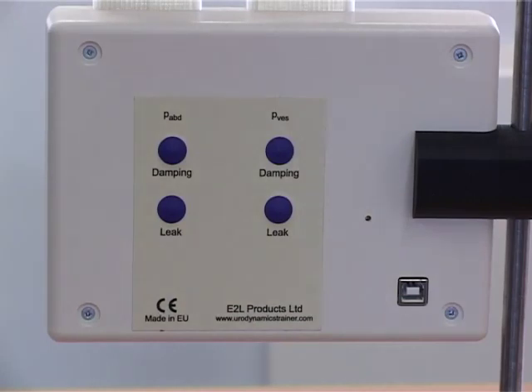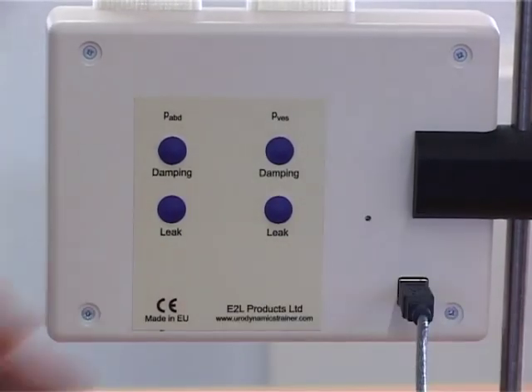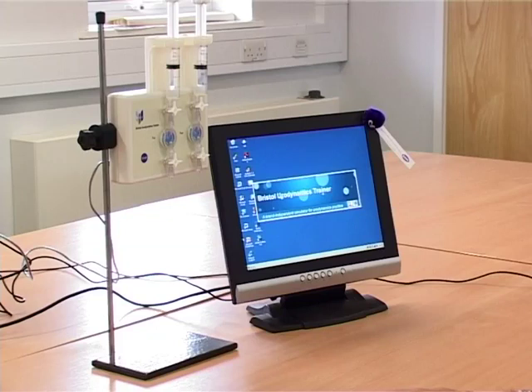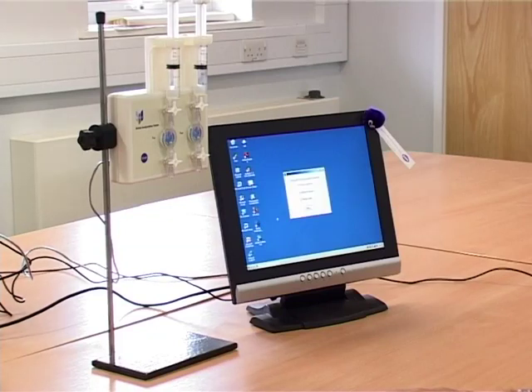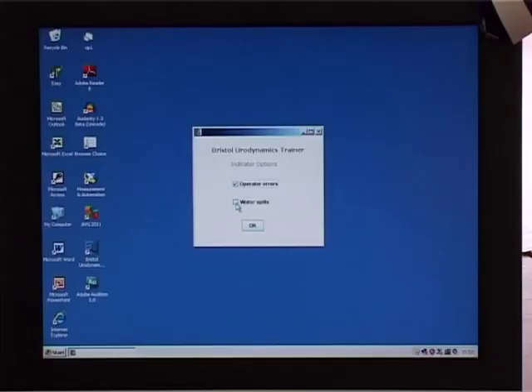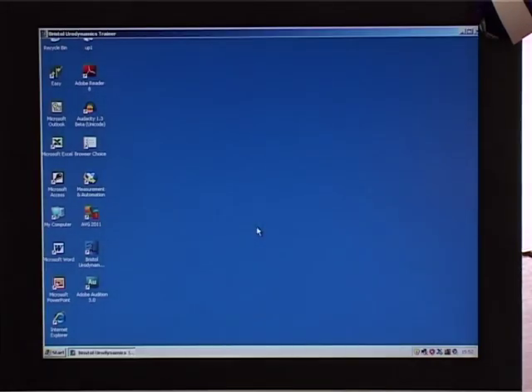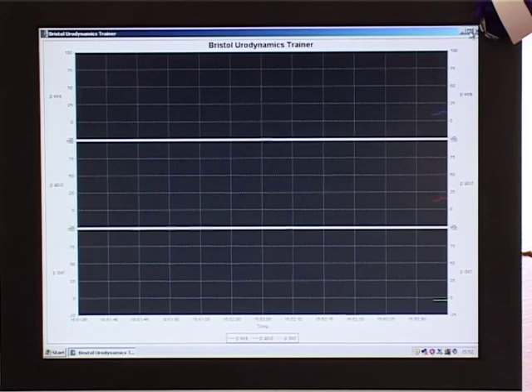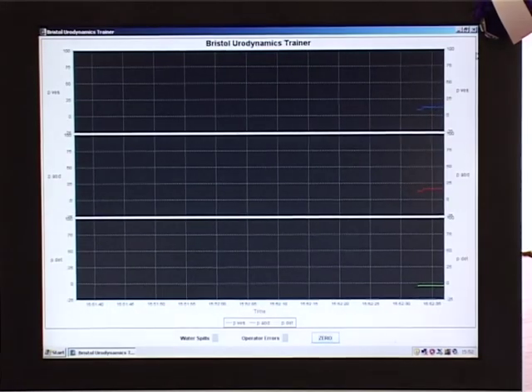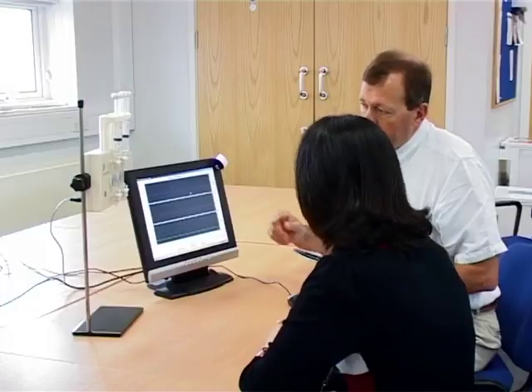The unit is connected to the computer using the USB connector on the rear. For training, select both error alarms and ask the trainee to set up the system for zeroing to atmosphere at the start of the test.